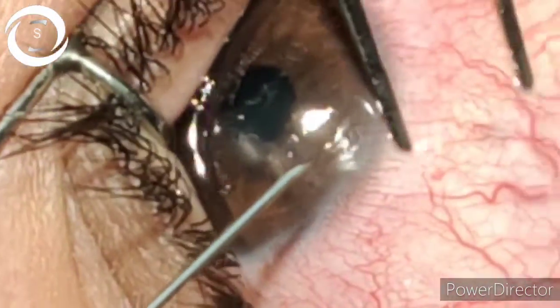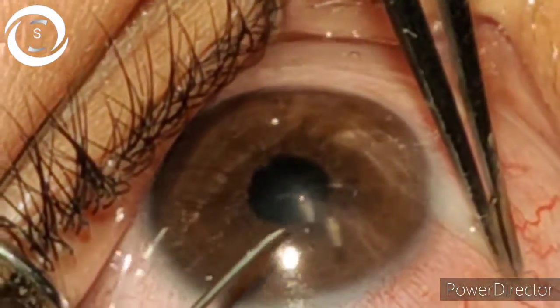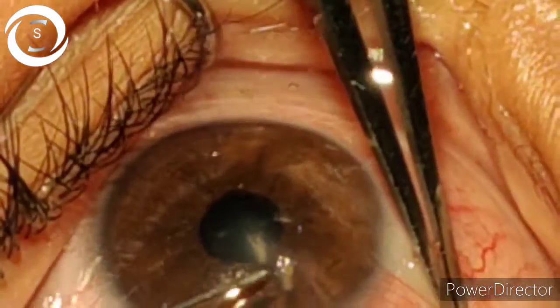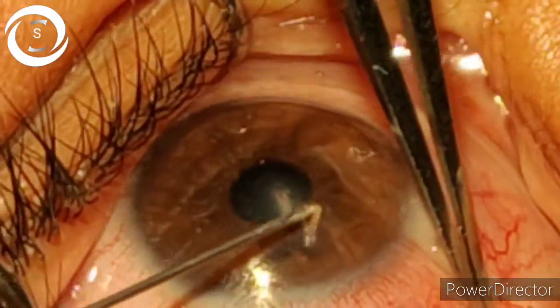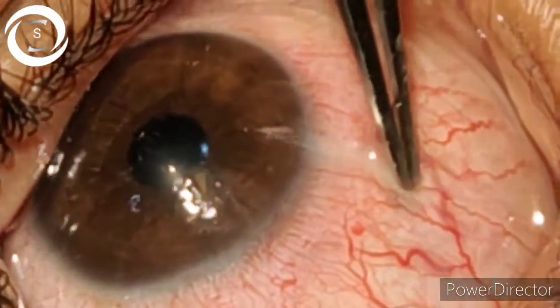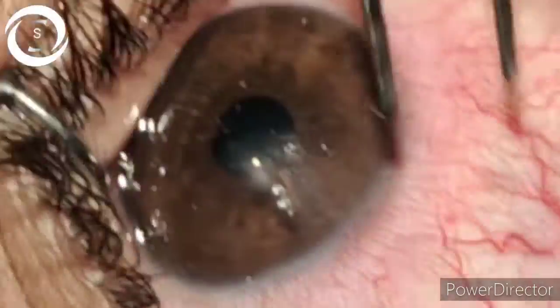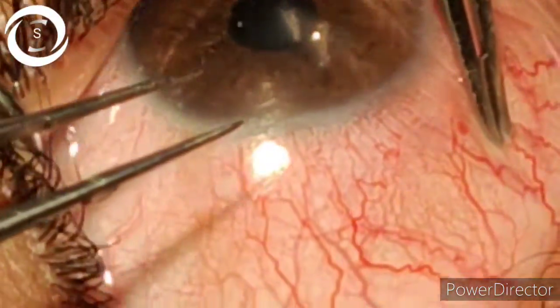Now we will try to remove the remaining piece. Again, you have to hold near the limbus, and with the help of a one cc needle I am trying to elevate the exposed tip of the second thorn. You can see that I have made a pocket, and now with the help of corneal forceps I will remove this second thorn as well.